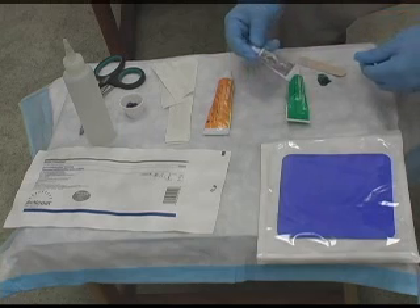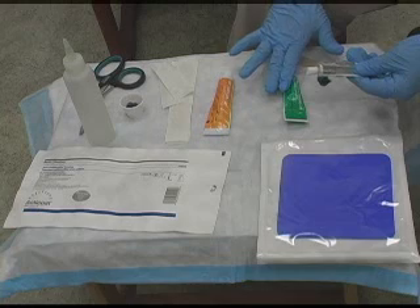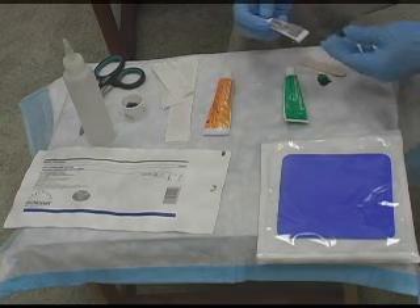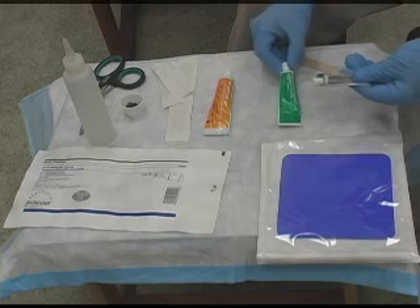Another product that we use is called Acuzyme. Acuzyme is just a papain-urea. It's similar to Panafil, except it does not have the chlorophyll. With Acuzyme, you want to make it a daily dressing change, whereas Panafil you can do Monday, Wednesday, Friday.